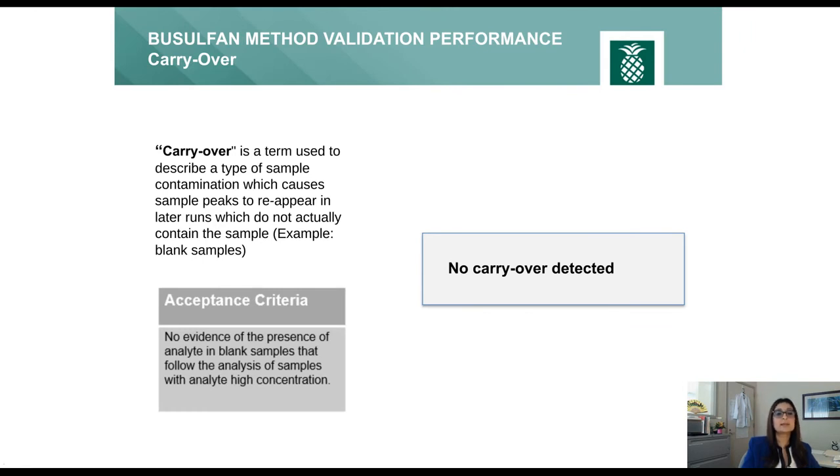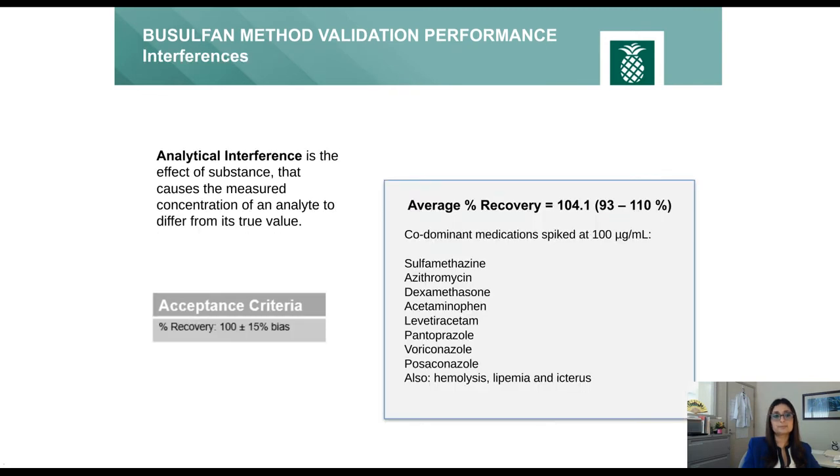Carryover was not detected in our validation process. We recommend a carryover assessment of every analytical batch by processing a blank quality control sample immediately following the high calibrator. No evidence of analyte must be in the blank sample. We did not detect interference with any of several concomitant medications spiked at high concentration.